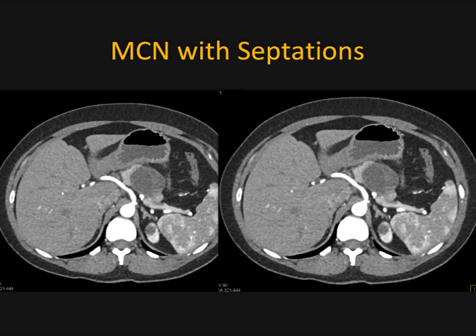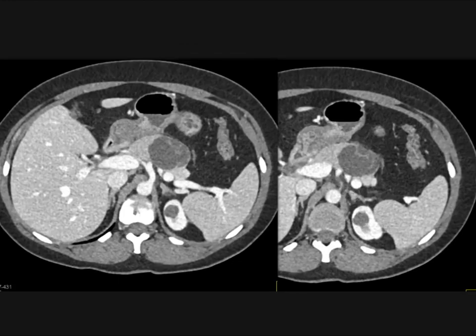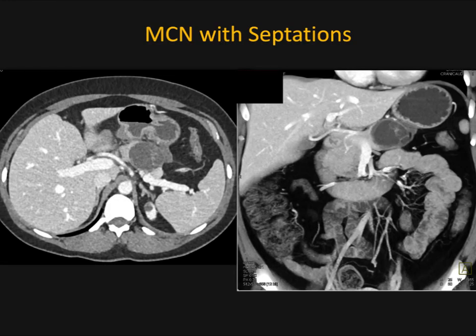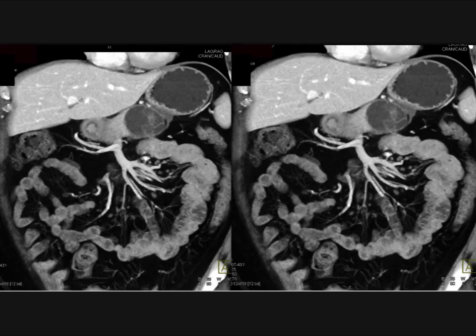Another example: a cystic lesion in the same classic body-tail location, but here you see thin septations. The septations are enhancing — you typically will not see them on non-contrast scans, though occasionally you might. It shows better on venous phase imaging, and this appearance is consistent with an MCN. Even without septations this lesion would be resected; with septations, the decision is definitive.